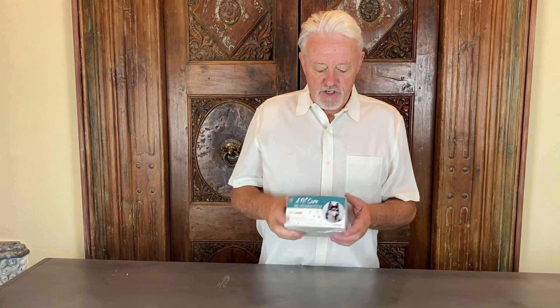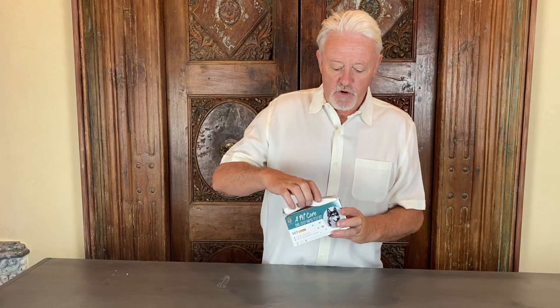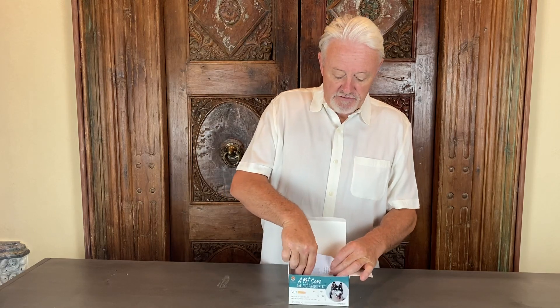We sell a number of products to test for potential problems in the dog and see if your dog is pregnant. I'm just going to show you one test box here — they're all very similar — but basically in each of these tests you either get five or ten test kits, and the test kit includes everything you need to do the test.